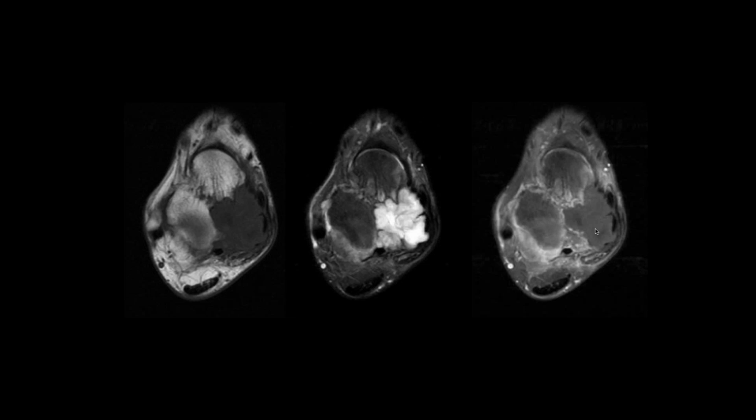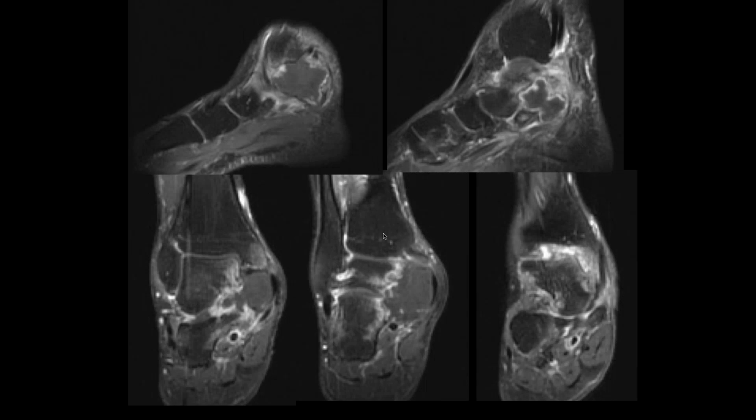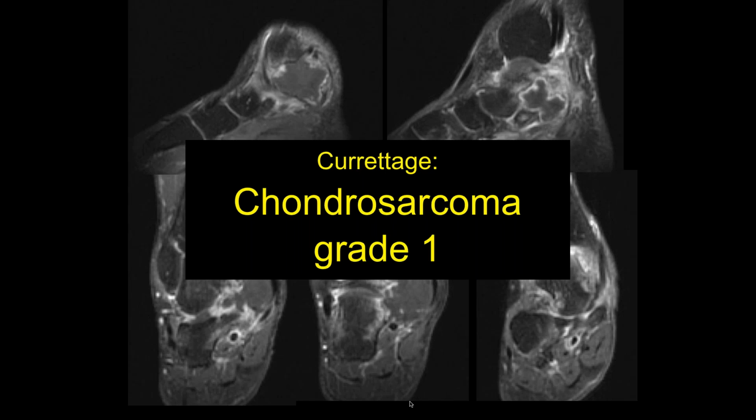This is a typical chondroid type mass. It's very kind of smudgy and more or less uniform, and it's non-enhancing. There's some irregularity here, but remember this patient had surgery before. So some of this bony irregularity could be surgery, but you have to be concerned that this could be extrinsically eroding the bone, which makes it more of a concern. And here, I guess there's a little bit of peripheral enhancement on these studies. This obviously is a much bigger mass than was present 3 years ago, and this turned out to be a chondrosarcoma.